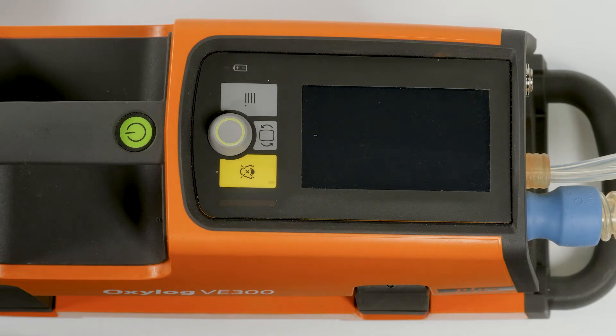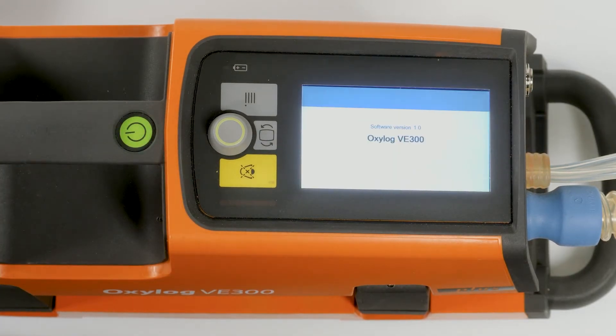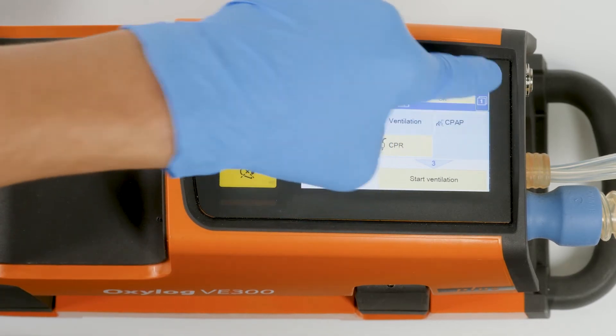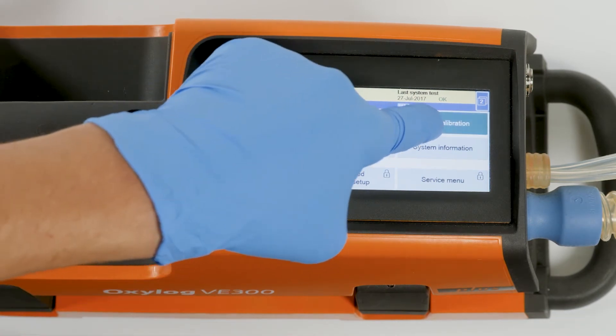The system test takes about one minute. To switch the ventilator on, briefly press the start-standby key. The ventilator performs an automatic self-test, then the standby screen is displayed. To move to screen two of the dialog, touch the button one in the top right-hand corner of the screen.